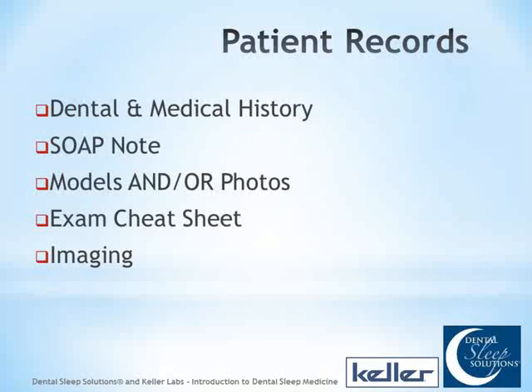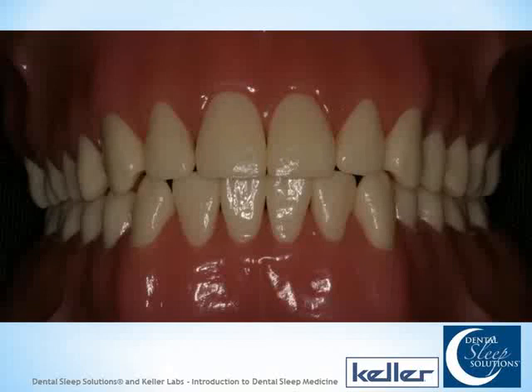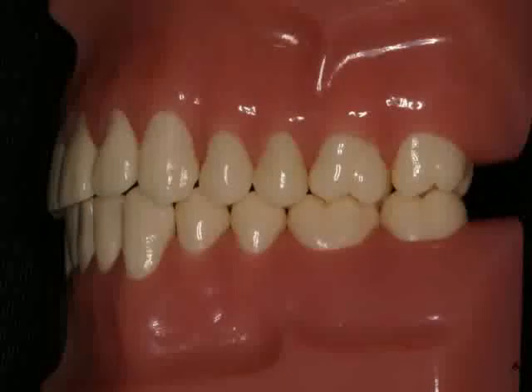When you take pictures of these patients, you want to take at least these four. You can do this in their mouth. You can do this with models where you just take one head-on, and you take one from the right, and you take one from the left, and then we just take the models and turn them upside down, and then we take another picture like that. So you can see contacts and where the teeth are, and we're just documenting for those reasons.